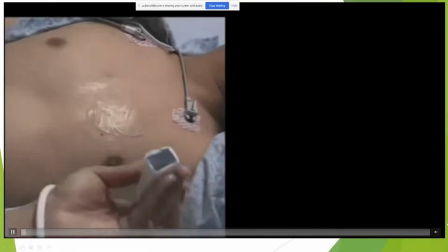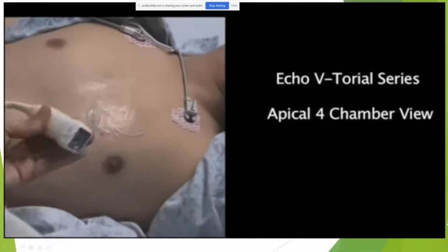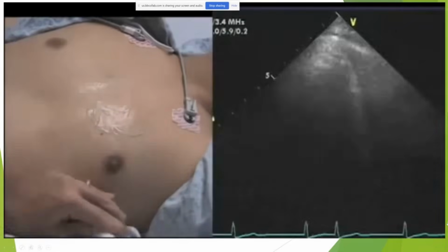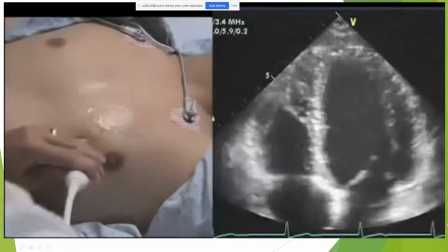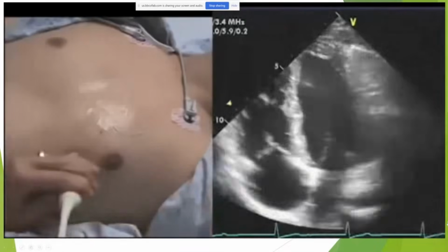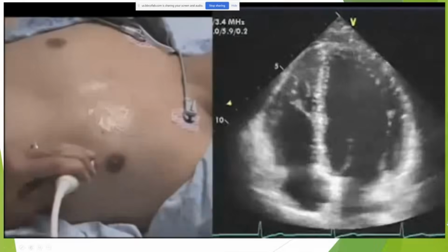So now we're going to work on finding best apical views. So I'm going to, again, put the probe down, and I'm going to do my circle survey, or I'll go window shopping and stumble into where the brightest image is for my apicals. This is a very nice apical view with a young person. And so I want to look at image composition here.